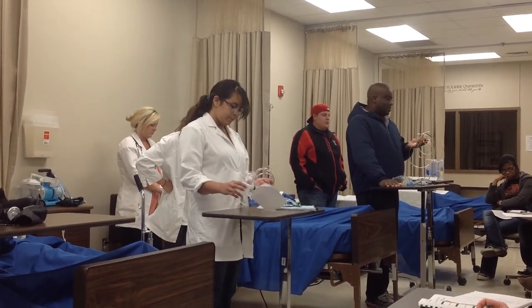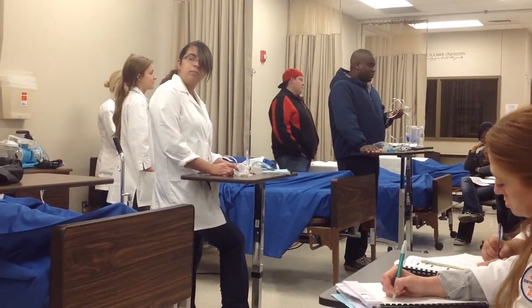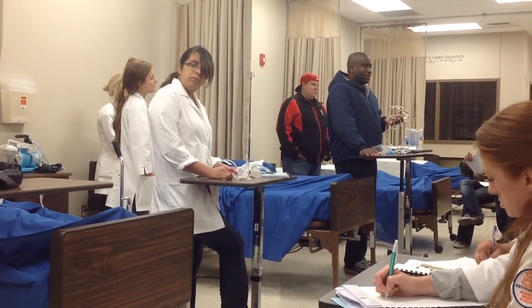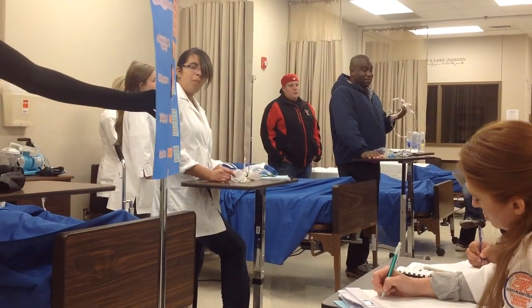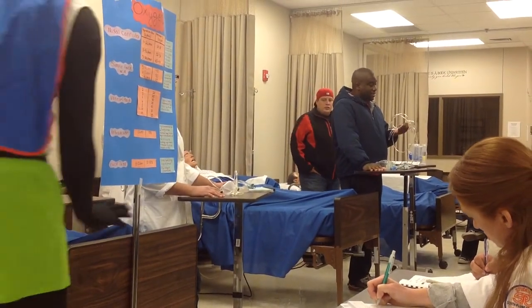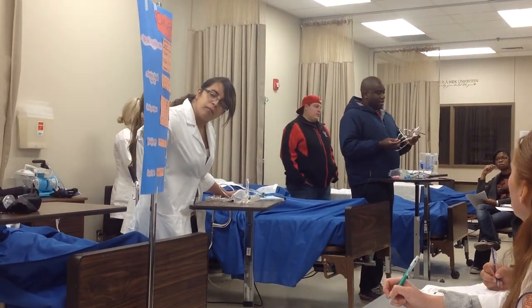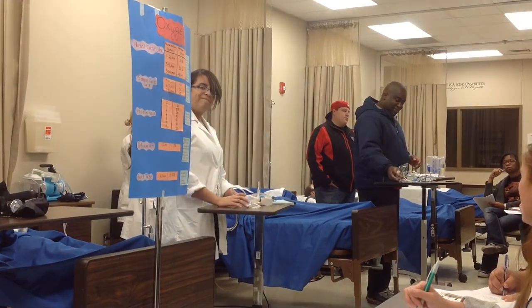What you need to know about it is it's used for short-term oxygen therapy, and it usually gives you 5 to 6 liters per minute at 40%, 6 to 7 liters per minute at 50%, and 7 to 8 liters per minute at 60%. And you have to remove it, of course, to feed the patient. So that's the simple face mask.